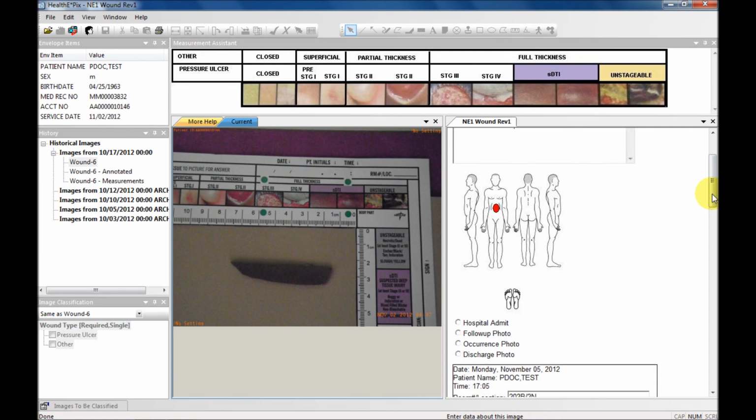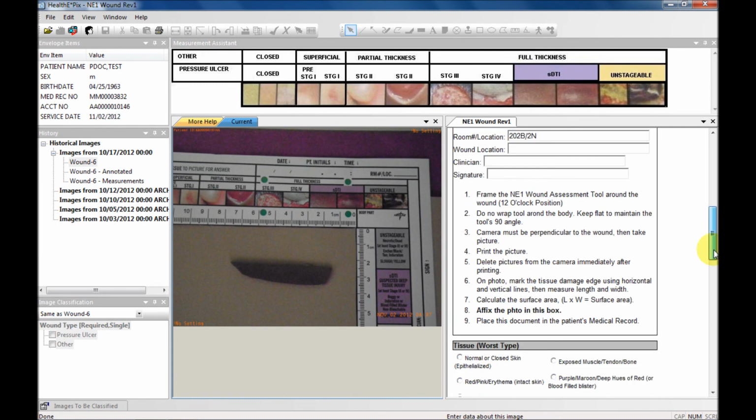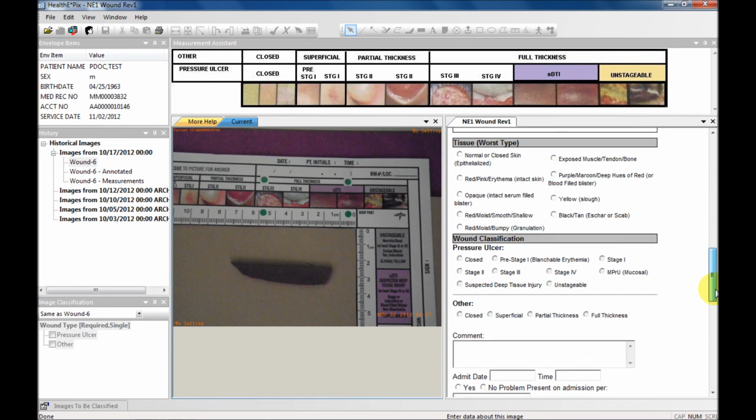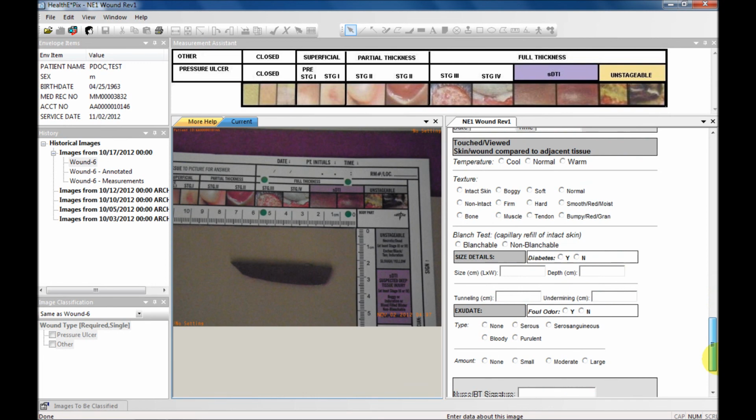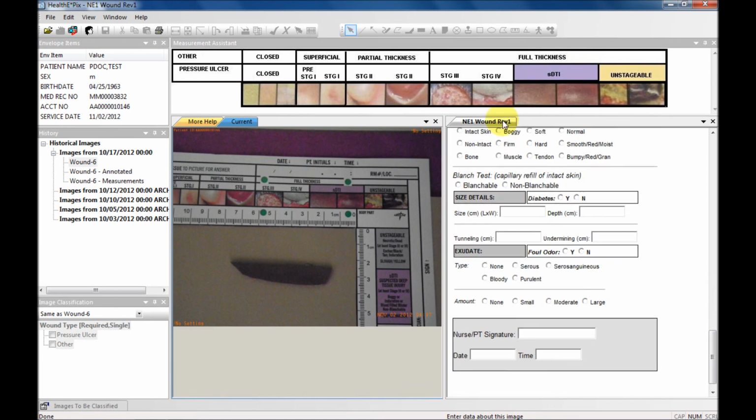As you can see, the form has a body locator object and supports numerous free-form multi-line text boxes with various instructions, radio button, and checkbox options. We move it back under a tab in the main pane and proceed to stage and measure the wound.